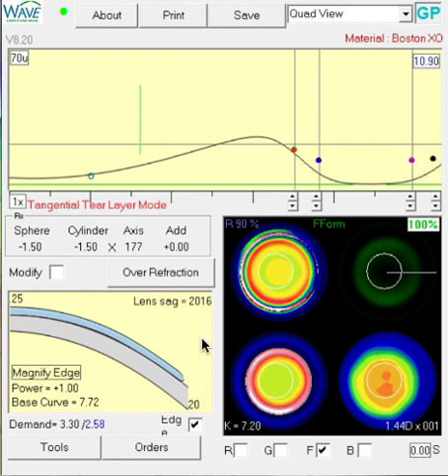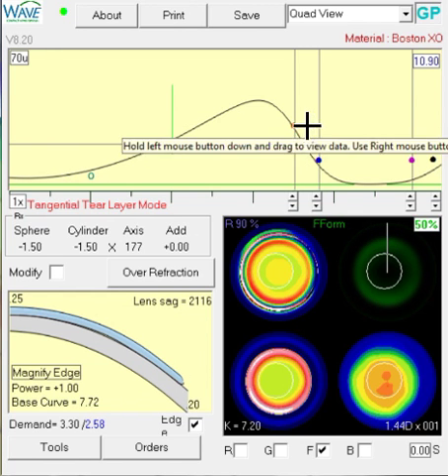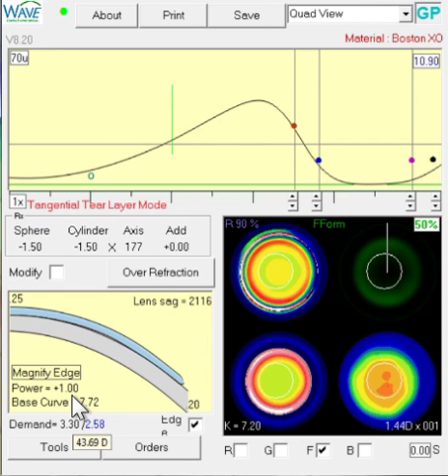Here we're back to the lens that the patient's currently wearing, and now I'll show you how to just increase topo demand vertically without going to an oval zone. This one's actually a little bit easier. We're going to do the exact same thing, build in about a diopter and a half, but we'll do that without moving any of the positions of the edges of the curves.